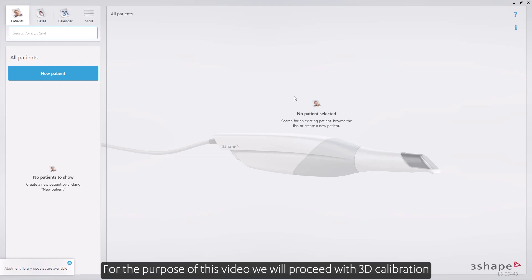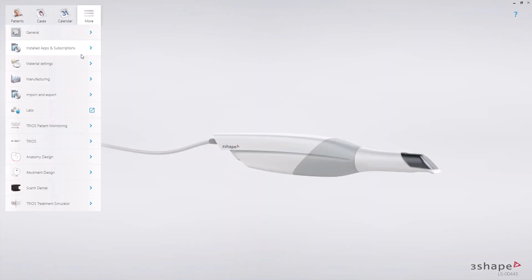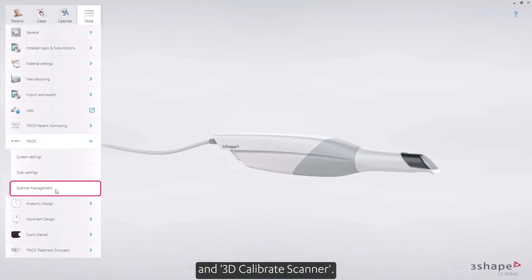For the purpose of this video, we will proceed with 3D calibration from the settings page. Select Trios, Scan Management, and 3D Calibrate Scanner.